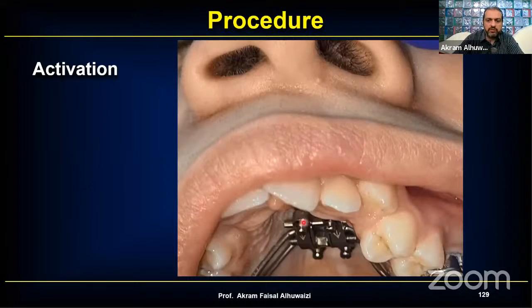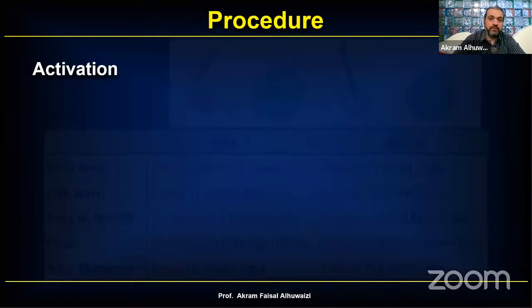This does nothing. If you push it back and then push it back immediately again, you've done nothing. You should just push it back and pull it out. So giving the patient the video helps quite commonly. It's very helpful so that the patient can have it as a point of reference.